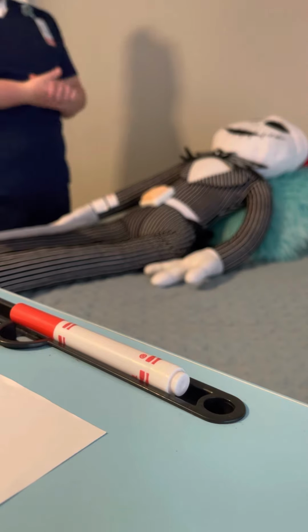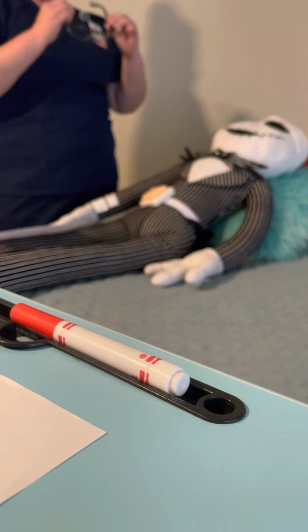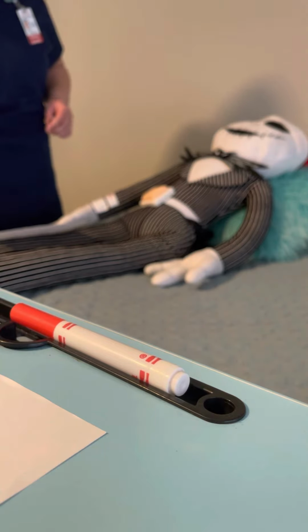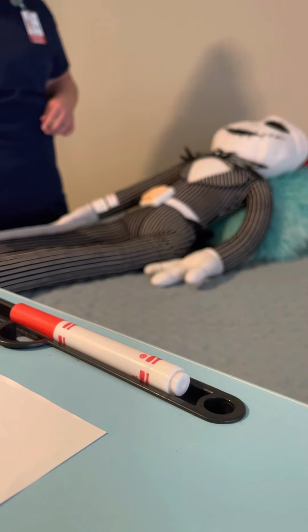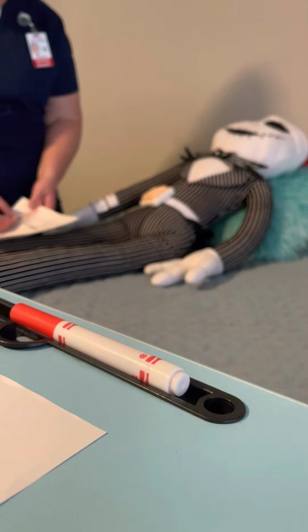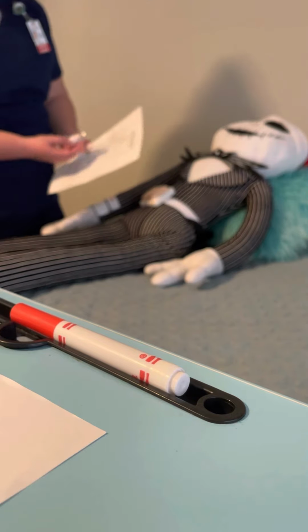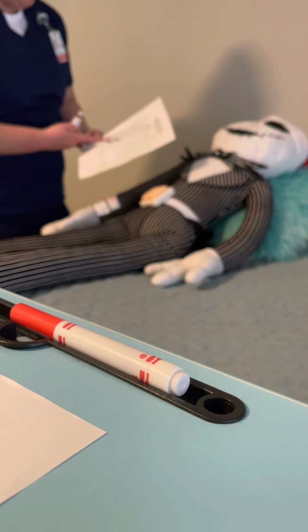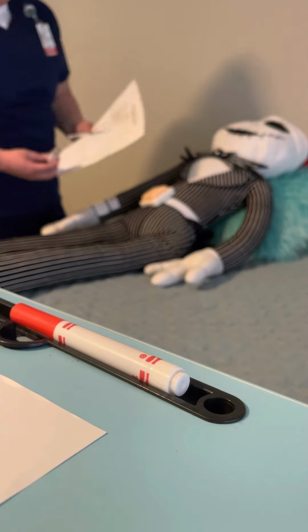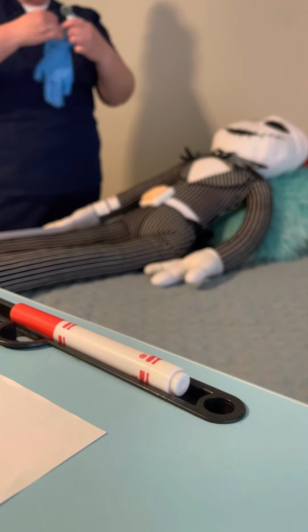My hand hygiene. Don my goggles. I'm going to make sure we do right patient. So I have Jaguar J. Jones. And I have heparin vial, heparin 0.5 milliliters in here, heparin 5,000 units or 0.5 milliliters here. Now I'm going to don my gloves.